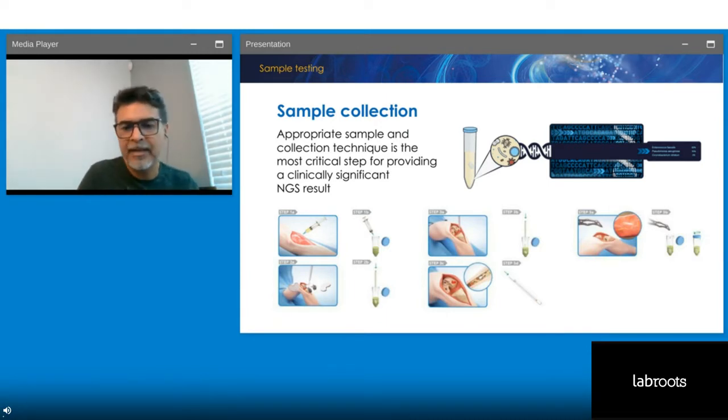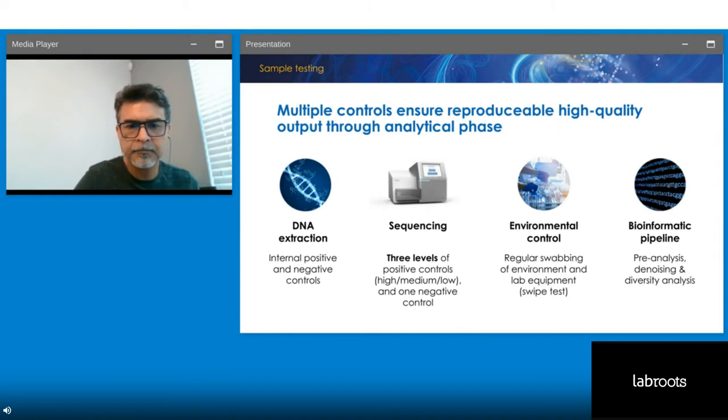and this is a responsibility of the provider and the clinician who is requesting the NGS to provide a high quality sample, and the laboratory can then provide the rest of the high skillful technique to make sure that we don't introduce any contaminant during the analytical process in the laboratory. So we have to ensure a high quality and reliability of NGS.